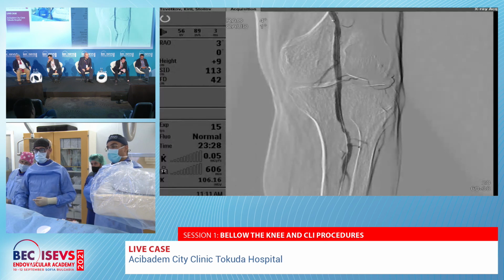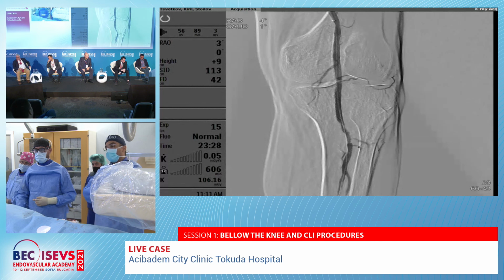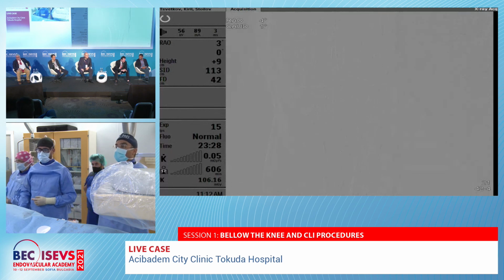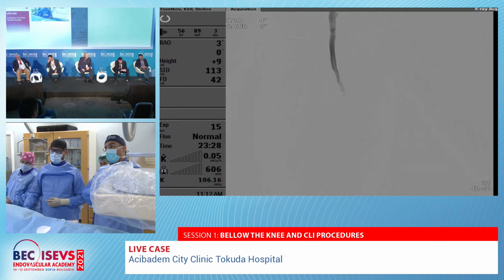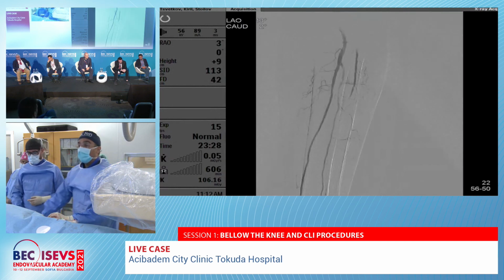This vessel had some kind of stenosis there. So for this reason we used a self-expandable stent. Is this Supera? No, it's not Supera, it's a Pulsar 018. This is after the balloon, the P3 segment. And now the next one was what I showed you with the posterior tibial artery.